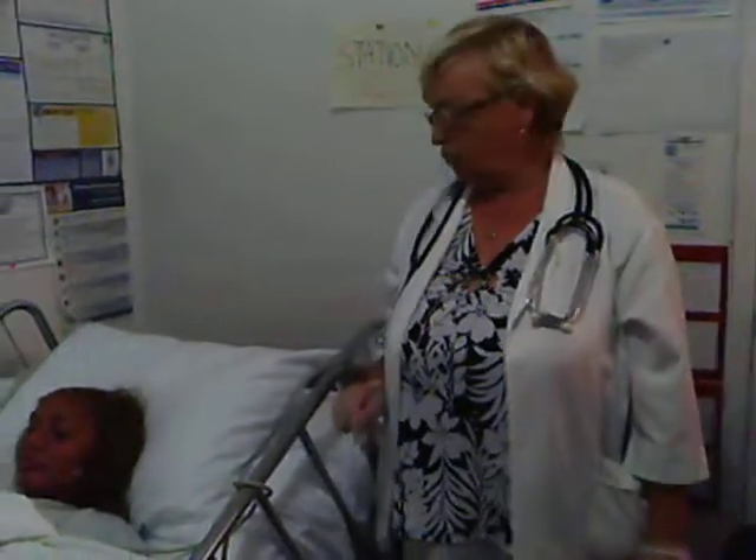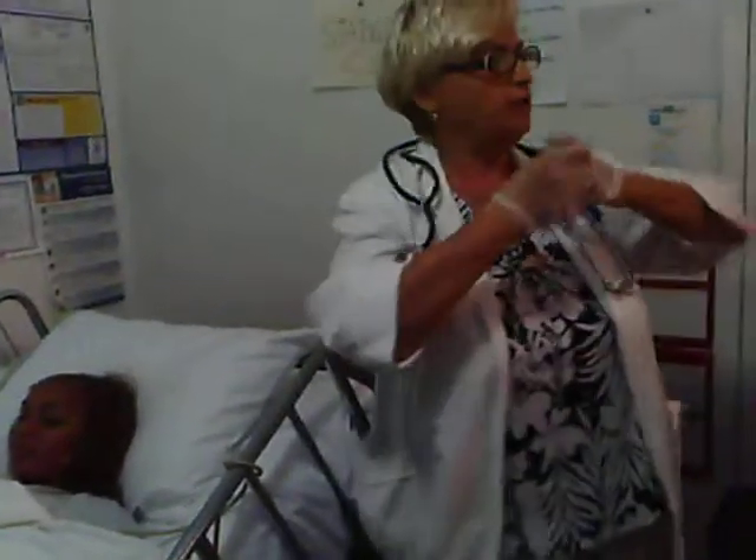I am going to report and chart. Wash my hands and report and chart. I am going to report the patient's weight. I have to write down: W/P equals one hundred fifty-three point twenty-five pounds. That's it — be careful.